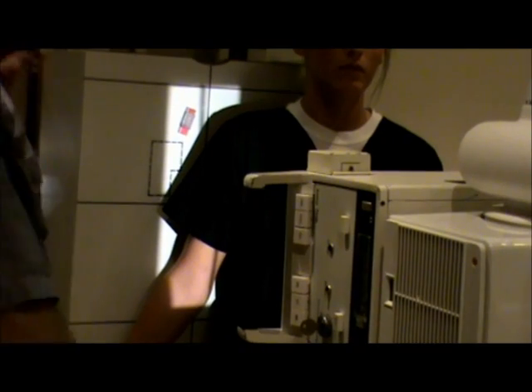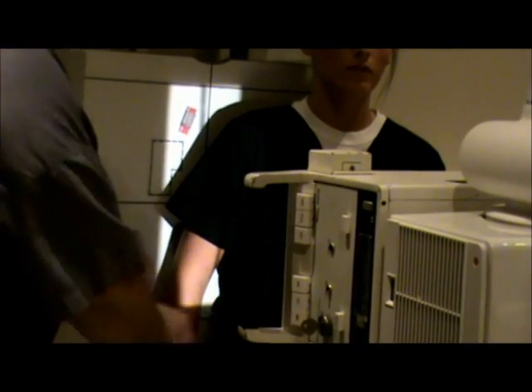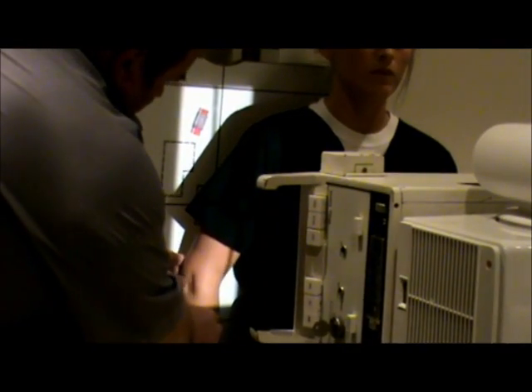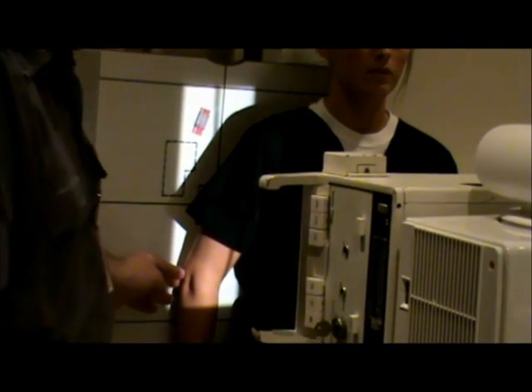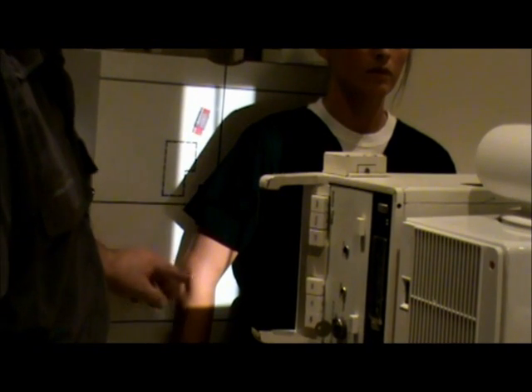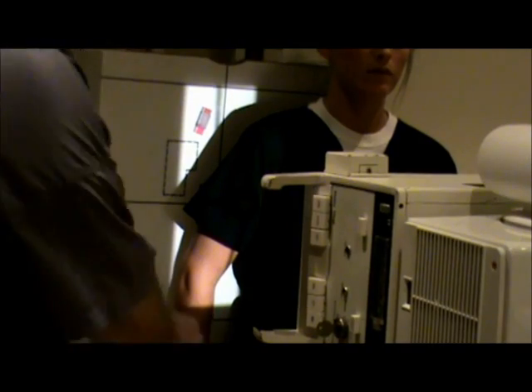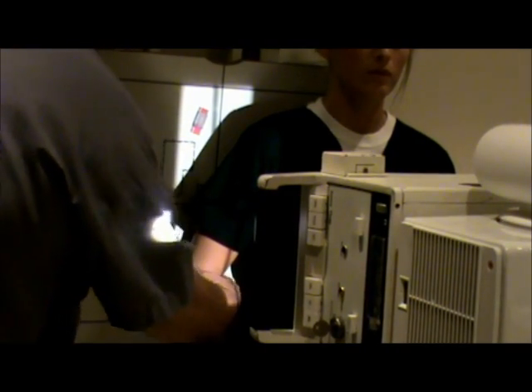Now for our lateral humerus, we're going to rotate the arm medially so that the epicondyles are now perpendicular to the IR. The centering remains the same — mid-humerus — including proximally the humeral joint and distally the elbow joint. Again, the epicondyles are perpendicular.